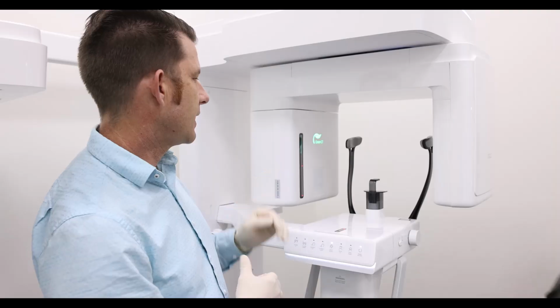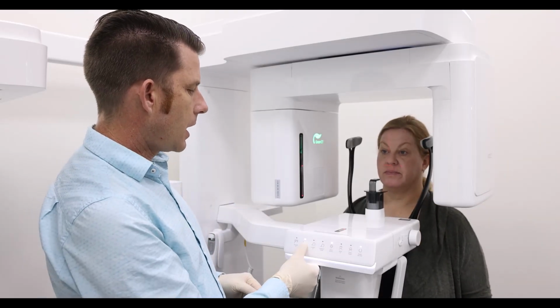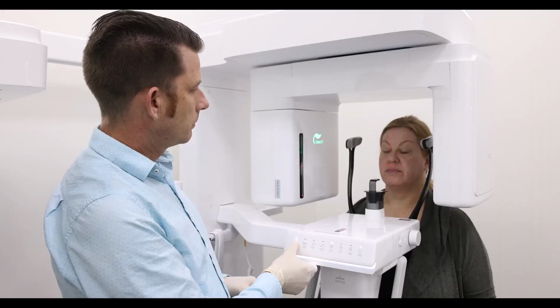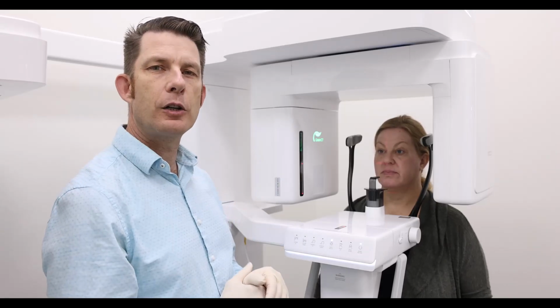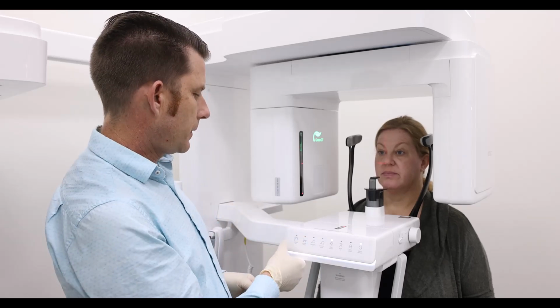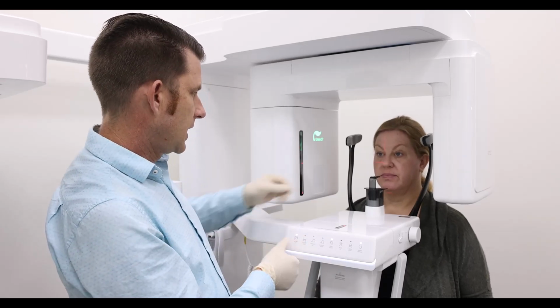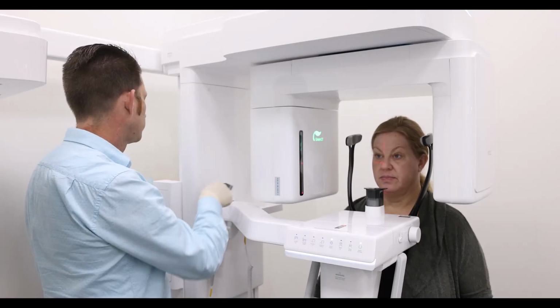I'm going to go ahead and stand up straight and tall for me. I'm going to go ahead and raise the column up. And with CBCT capture, I want the patient with a flat occlusion, the occlusion being parallel to the floor. So I'm going to go ahead and raise this up. We'll grab our bite stick with its cover.